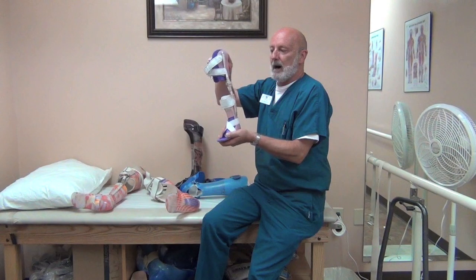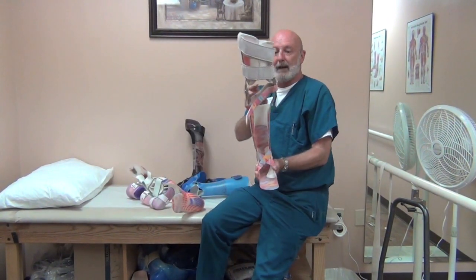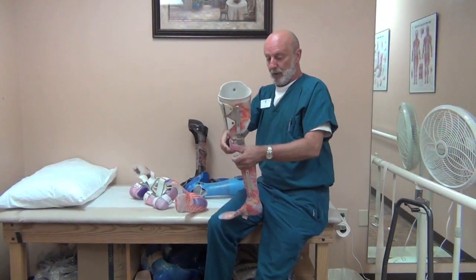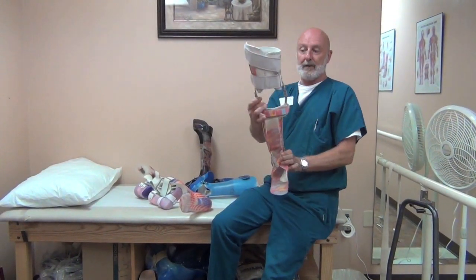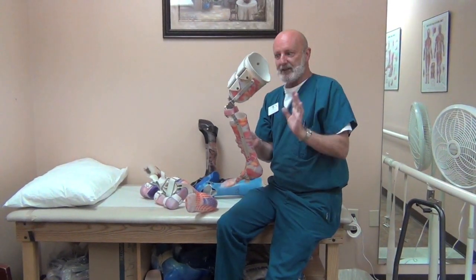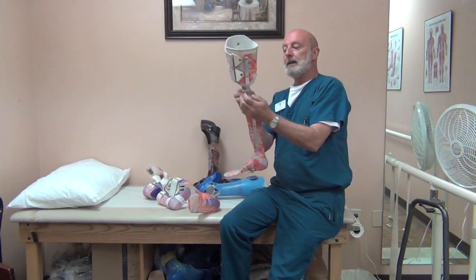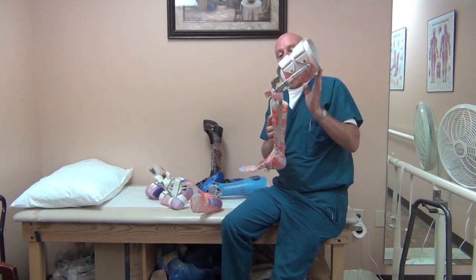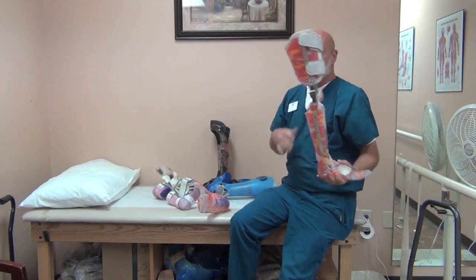Once kids get a little bigger, you need a double upright design. An infrapatellar strap holds the knee from buckling inside the brace, along with a solid AFO section with drop locks. This patient needs the knee locked — as soon as they stand up the knee locks, and when they want to sit they simply raise the joints to unlock the knee. As soon as they reach full extension again, it automatically locks.